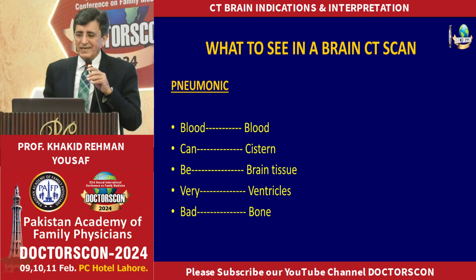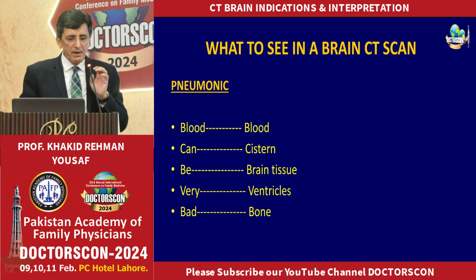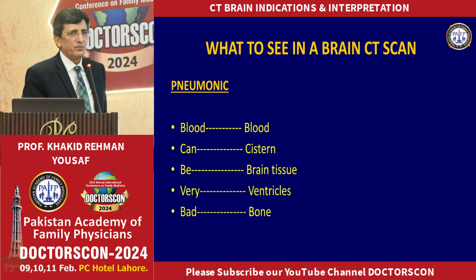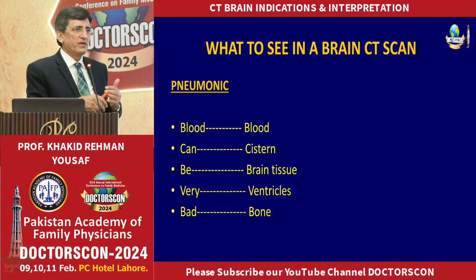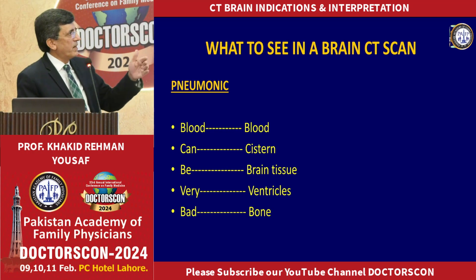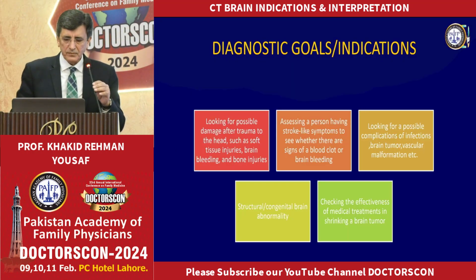So what to see in a brain scan? When you come across a brain scan, what to see? Remember a mnemonic: Blood Can Be Very Bad. B stands for blood, C stands for cistern, B stands for brain tissue, V stands for ventricles, and B stands for bone. If you remember this sequence, you will have something in your mind to look at. We have to see blood, cistern, brain tissue, ventricles, and bones.